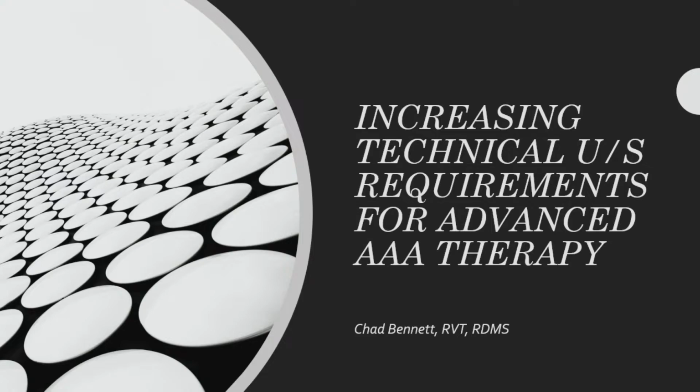So this talk, I'm going to be talking a little bit about the increasing technical ultrasound requirements for advanced AAA therapy. Dr. Lassar loves to give me long titles and then let me figure out how to get after them. So we're going to talk a little bit about AAA, abdominal aortic aneurysm, and what some of the intervention to prevent that is, and then what that means for ultrasound as far as what we need to look at.